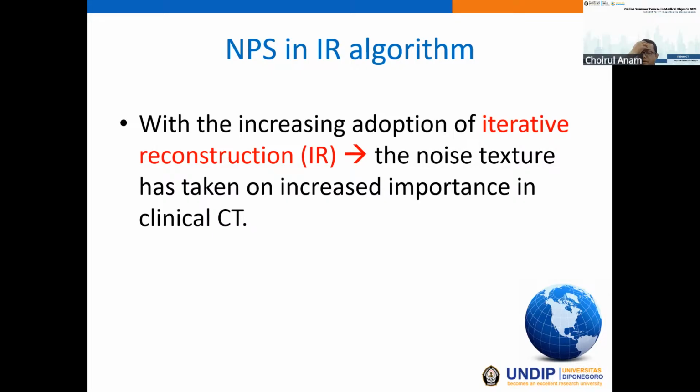So with the emergence of the IR or DLIR in the clinical setting, it is important for us to measure not only the noise level but also the NPS, noise power spectrum.